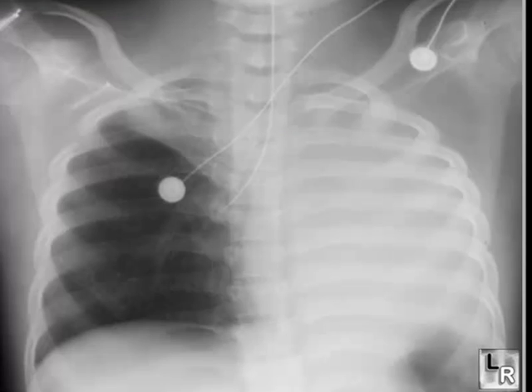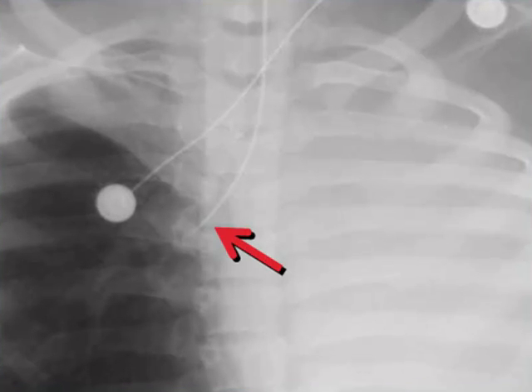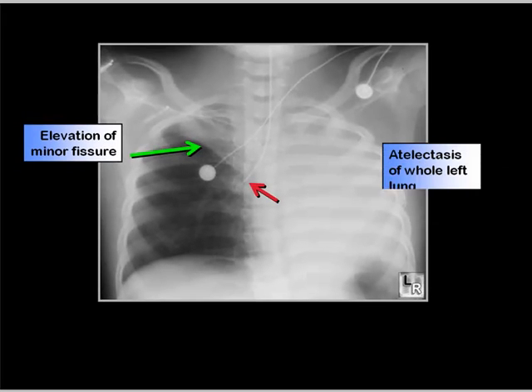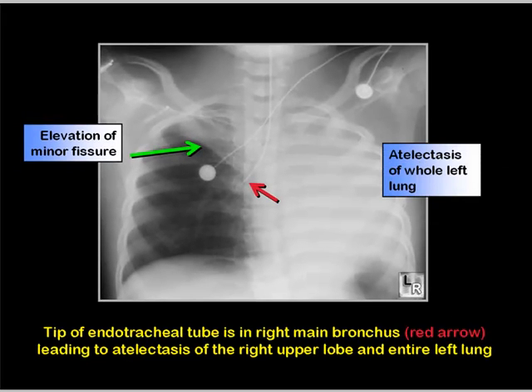Following the insertion of an endotracheal tube, this image was obtained. The tip of the endotracheal tube is in the right main bronchus. That has produced atelectasis of the right upper lobe, as evidenced by increased density in the right upper lobe and elevation of the minor fissure, and complete atelectasis of the left lung.